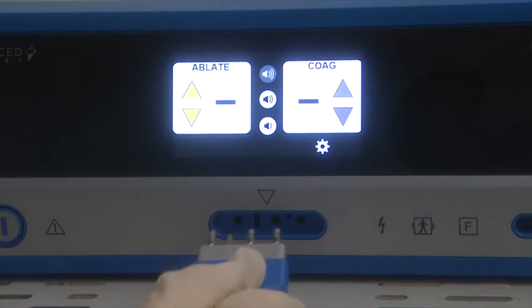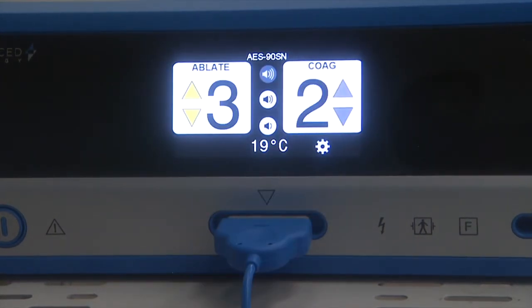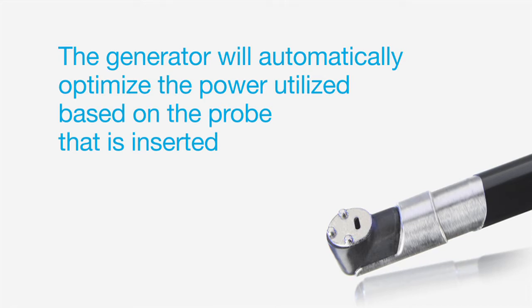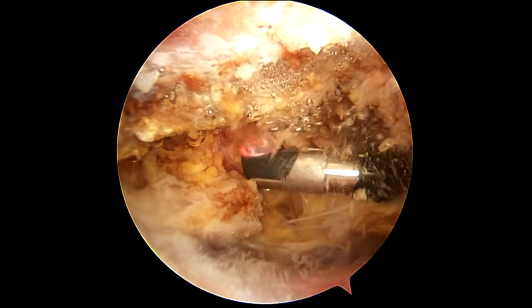To install a bipolar probe, simply insert the probe connector into the port on the front of the generator. The type of probe installed will appear on screen. The generator will automatically optimize the power utilized based on the probe that is inserted, efficiently and effectively generating a strong and stable plasma layer.